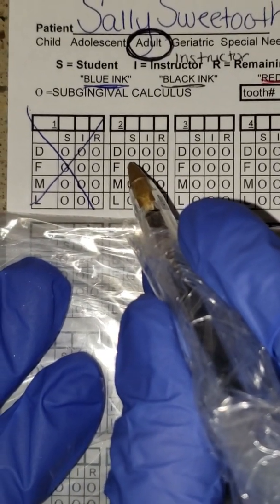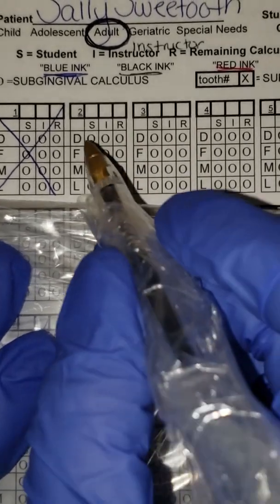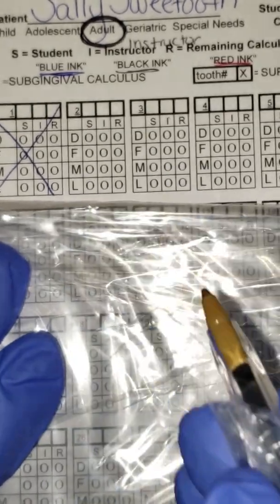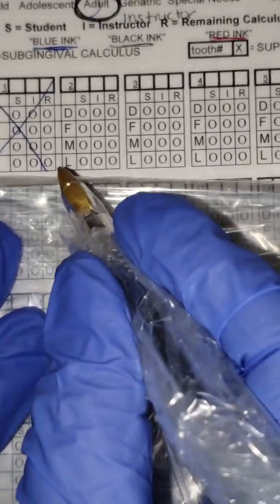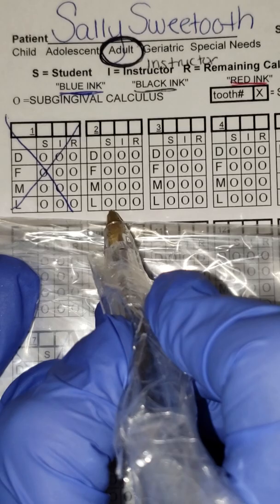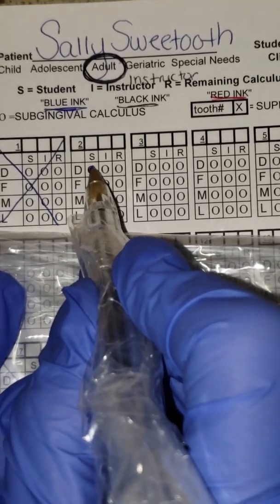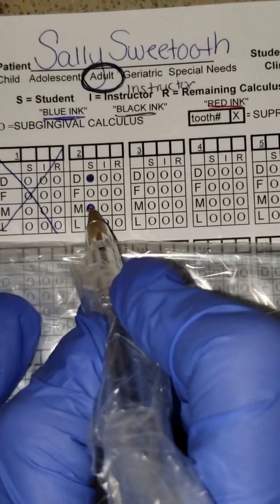speed bump calculus or deposit, where you can go subgingivally and feel the actual speed bump. So this shows me the S is the student, that's me. Blue pen, let's say the distal of tooth number 2, I can feel a definitive speed bump, and the mesial.